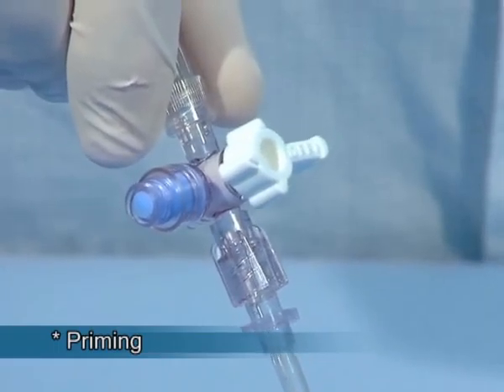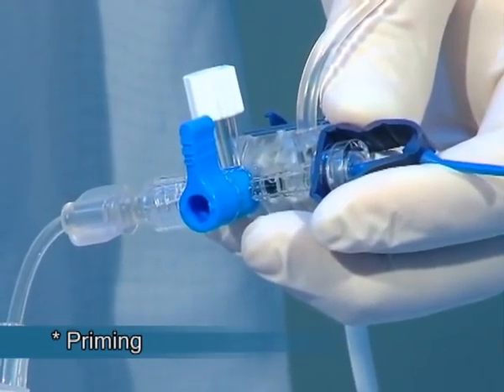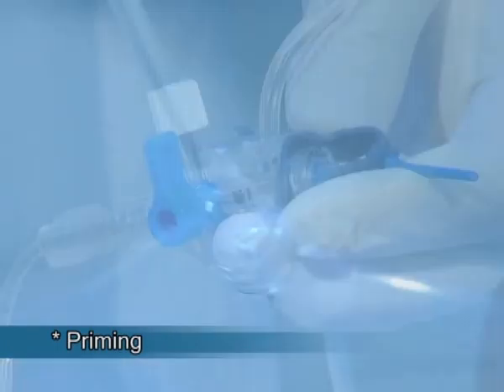Priming: The set is primed by activating the flush device. The unique design of the Marvelous enables priming while minimizing the risk of air bubbles.